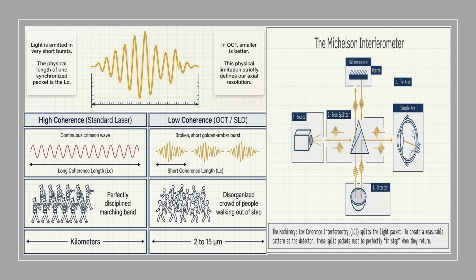Now, if we look at the Michelson interferometer, which is present in the OCT, the difference between one machine and another is based on the light source. Now, this is the light source. As we said before, in spectral domain OCT, we use superluminescent diodes to provide this burst of light, or in swept source OCT, we use a fine-tuned laser to provide this packet of pulse.